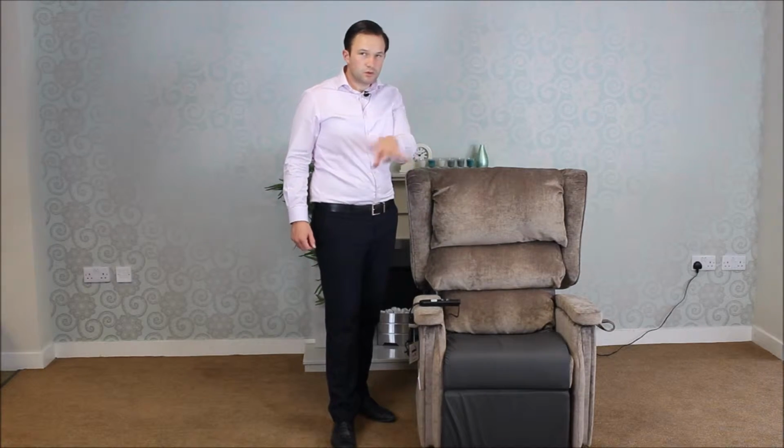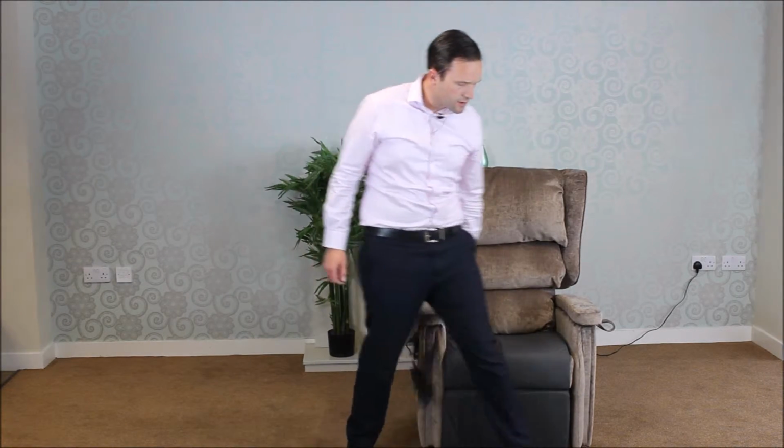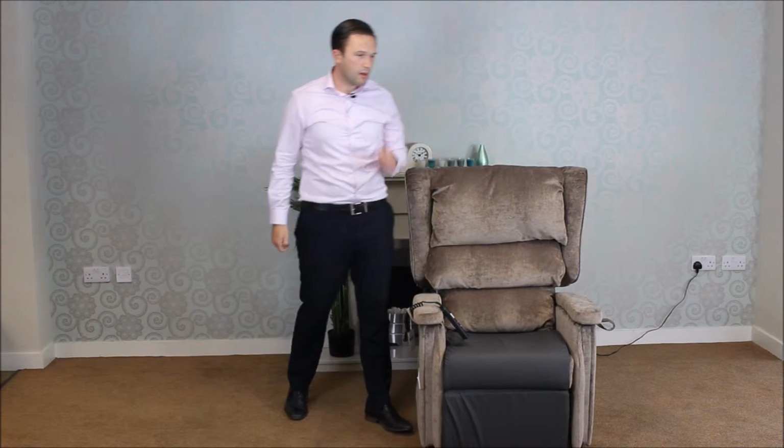Transfers. It's really important that the user is well back in the chair. If they're not, the armrest will appear too high. The postural options that you've fitted to the chair will also appear too high, and when they tilt the chair back and raise the legs, the feet will hang off the end. So transfers are really important, and this area is often quite difficult because for users who are transferring into the chair with assistance, getting the pelvis to the back is often quite difficult. But if it's not, it's likely that the chair won't be comfortable. So first of all, do some work around the transfers and see that the user's pelvis is as far back as possible. Of course, transfer relates a little bit to size, and that's the next thing we're going to talk about.